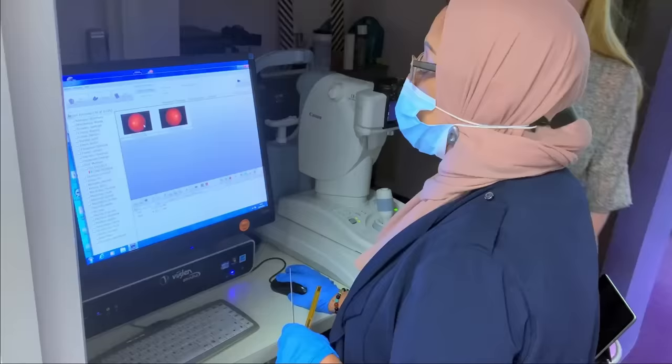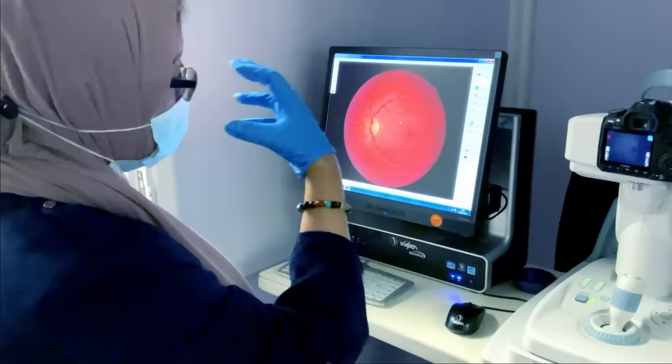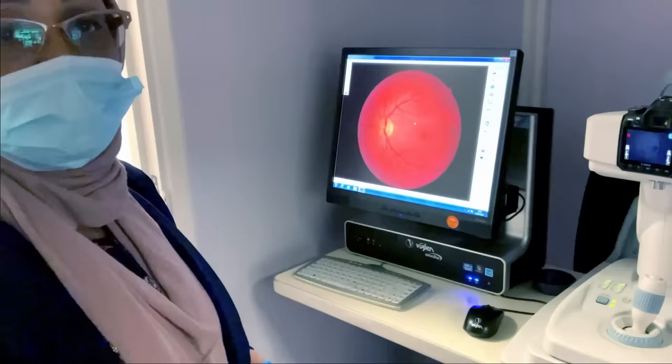So this is the back of your left eye. Absolutely beautiful. These are your blood vessels that come in from the brain. There's a whole pool of blood vessels in the brain called the circle of Willis. Then those vessels come into the eye, through your optic nerve, and onto the retina. This is your optic nerve, the pale part, which is the nerve that travels to the back of your brain. That's what we were measuring when we were looking at the field of vision, just to make sure the nerve is in good condition.